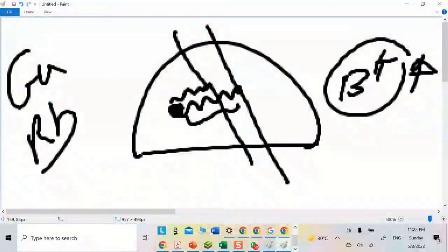But the resolution will be affected by the positron energy, which is referred to as the positron range, the range in which the positron moves. If the positron moves further away, the location of the annihilation will be affected, which will impact the accuracy of localization when determining the location of the activity or the radioactive isotope. This is referred to as the positron range.